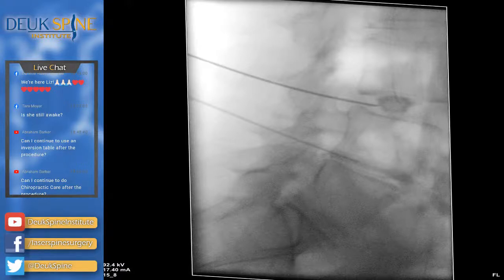Are you saying I got in the wrong hole, Luis? Yes? That's what you're saying. The wrong hole. No, that is a problem. Alright, let's get this in the right hole.